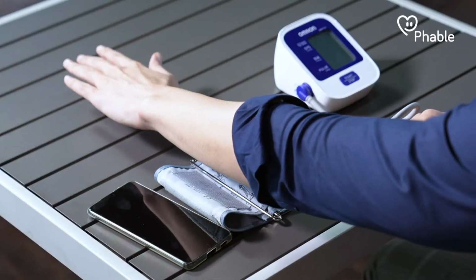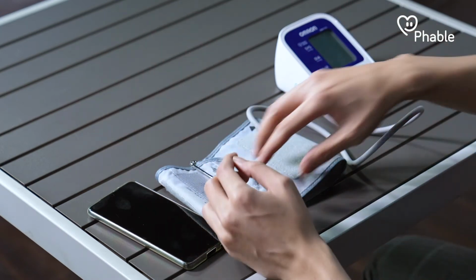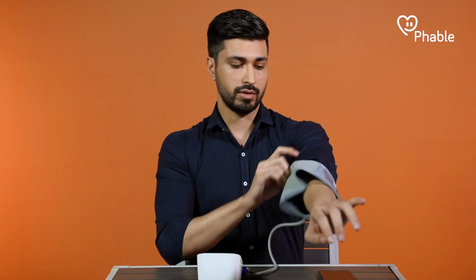Straighten and stretch out your arm. Your monitor should be approximately at the same level as your heart. Now, pass your arm through the cuff. Ensure that the bottom edge of the cuff is 1 or 2 centimeters above your elbow, and the marker is centered around the middle of your arm.